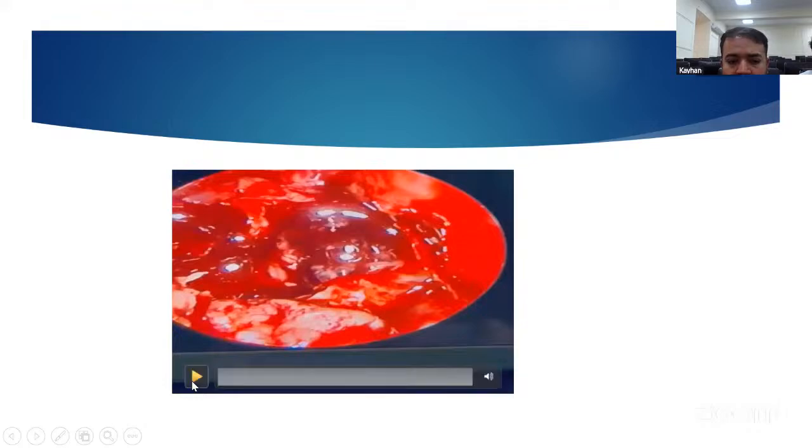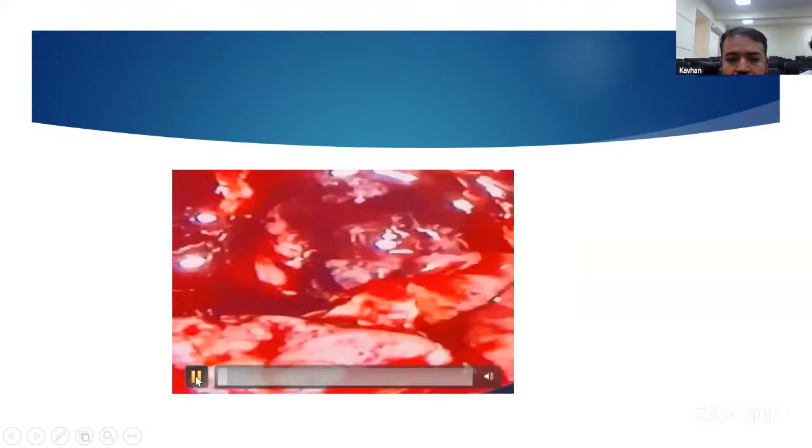This was another patient we went for surgery. He had bilateral decreased vision, but the lesion was, to some extent, with suprasellar extension, not too much in the sella. So we did his surgery. This is his post-op video. Alhamdulillah, he's doing fine as well. This is his end-op surgery video.